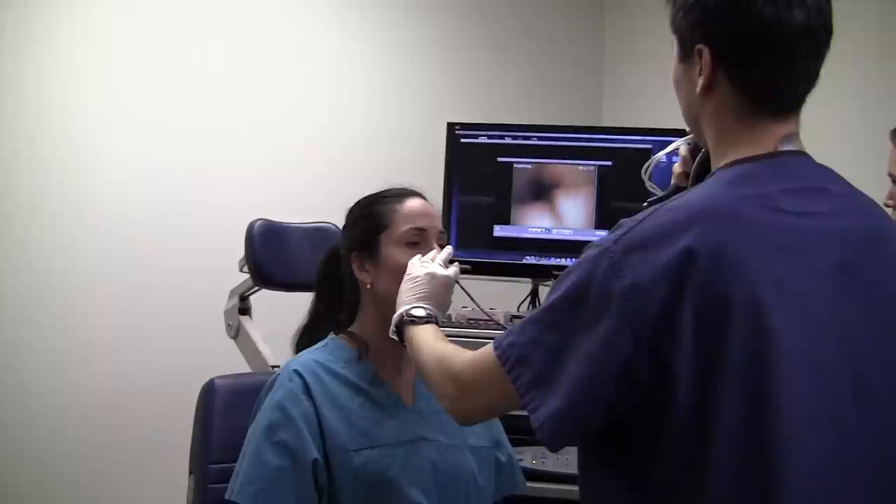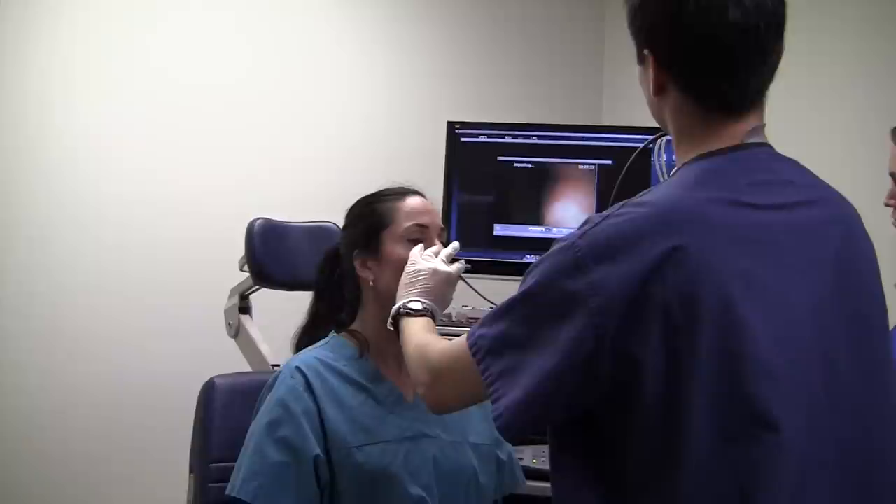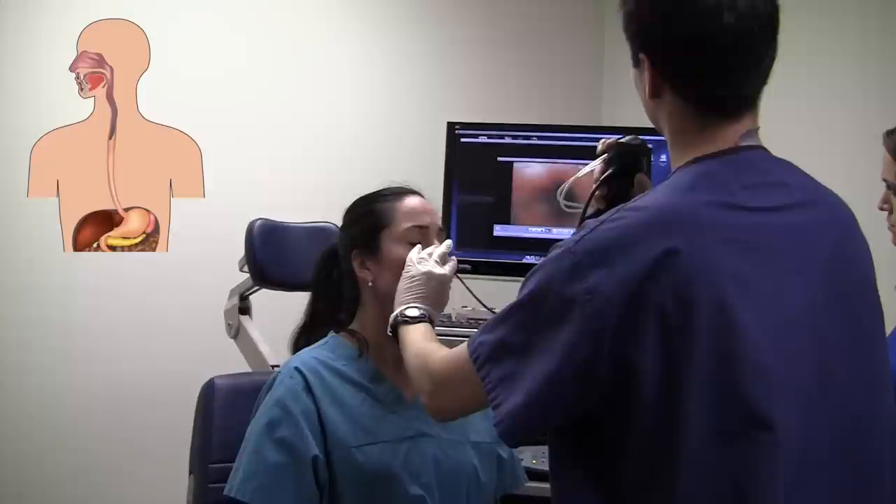The scope is gently threaded towards the stomach while the lining is carefully examined for any abnormalities. Here we have reached the point just behind the heart. Here we can see a clear border separating the esophagus from the stomach.